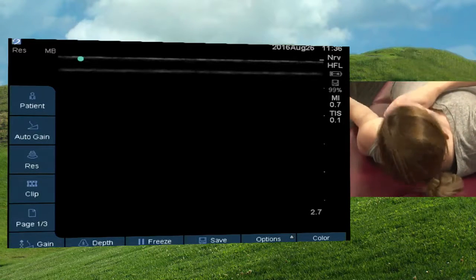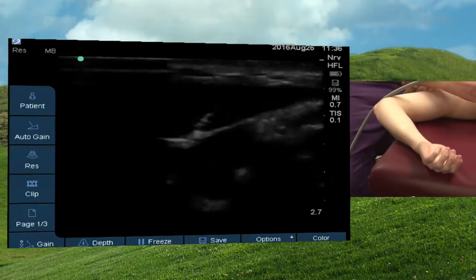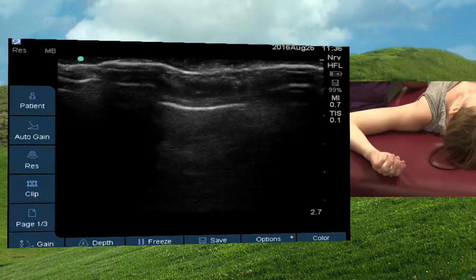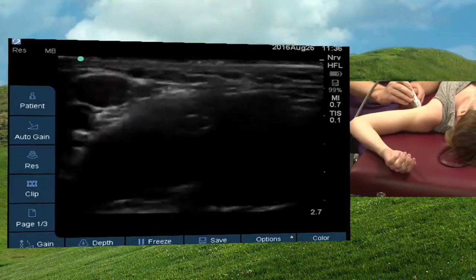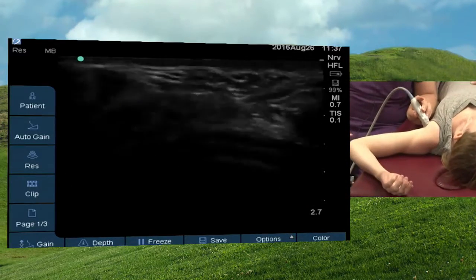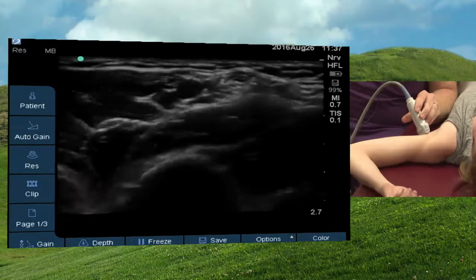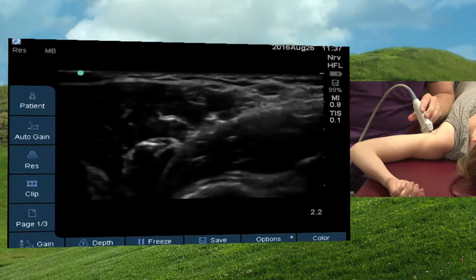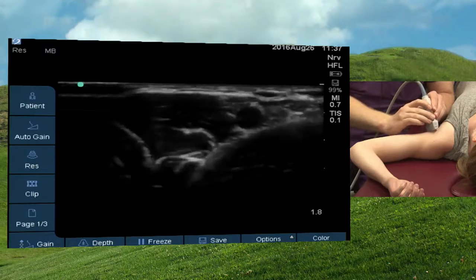So we'll have Beth bring her arm up. Now, I remember the first time I saw an axillary nerve block done, it was done without ultrasound. And the way that they used to do these is they would do what was called the Transarterial Technique. Let me find our artery here. I saw it. So here's our artery. Beth's got really good anatomy.